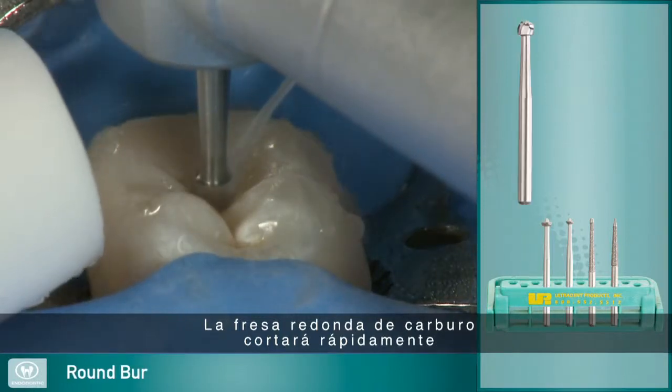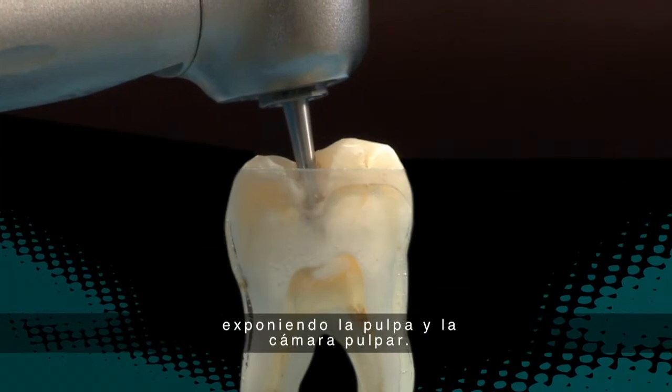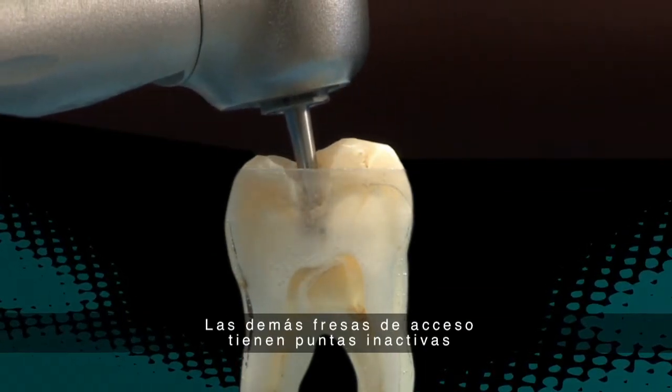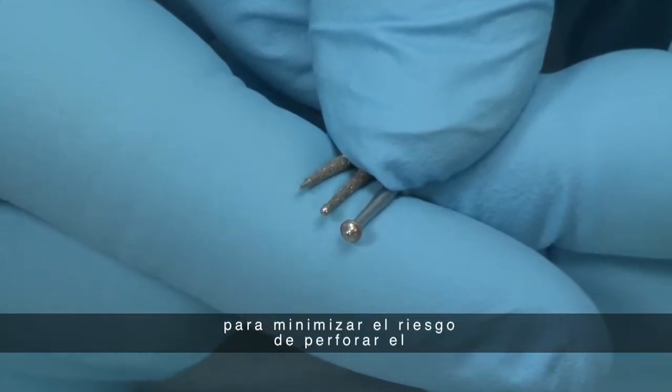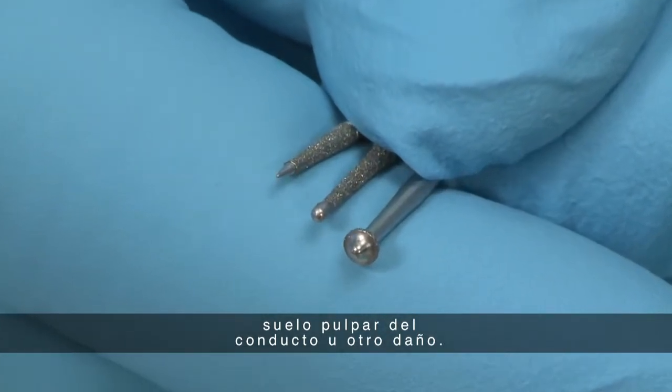The round carbide burr is used to quickly cut through the occlusal table of the tooth, exposing the pulp and pulp chamber. The remaining access burrs feature safe-ended tips to minimize the risk of pulpal floor canal perforation or other damage.